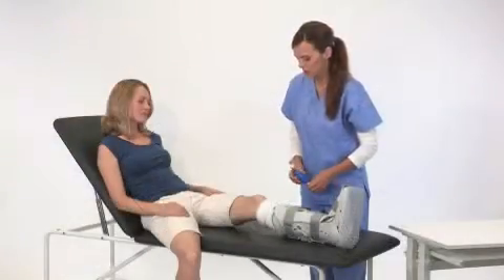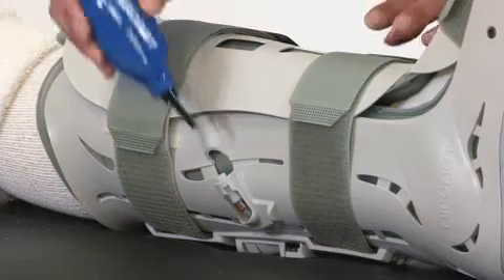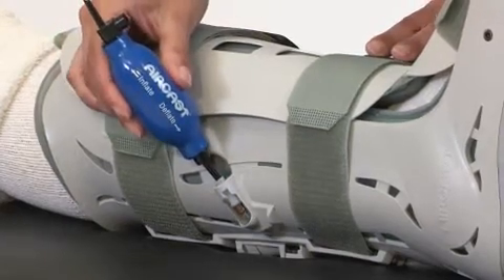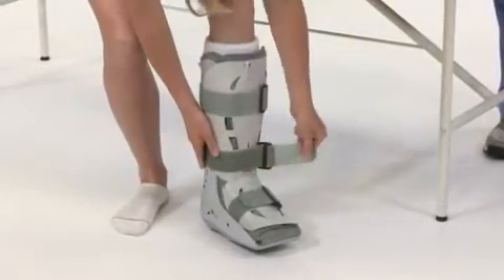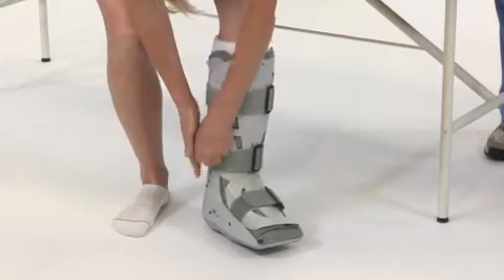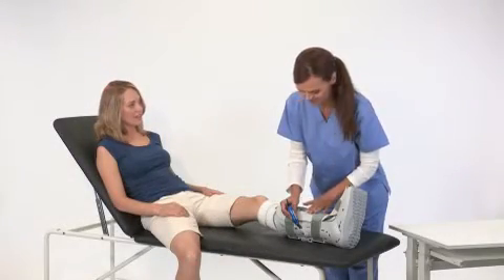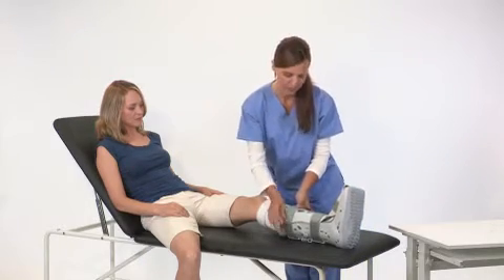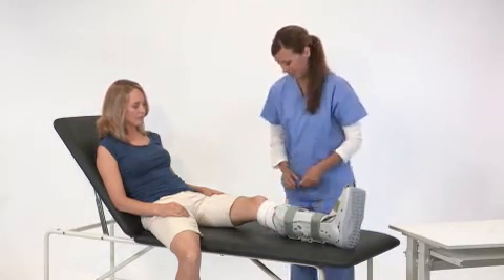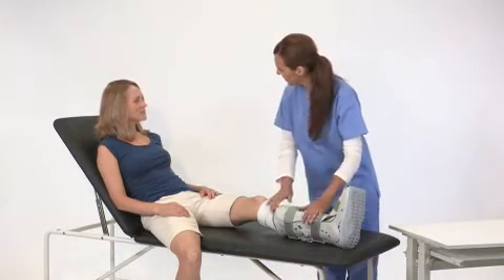If you over-inflate the air cells, simply deflate them by inserting the deflate tip of the hand bulb into the valve and squeezing until you've found a comfortable pressure. You can also adjust the pressure by tightening or loosening the straps. The brace is more comfortable when pressure is higher in the air cells on the inside and outside of the leg than the air cell on the back of the leg. Higher pressure provides more support for walking. Lower pressure is more comfortable when sitting or reclining.